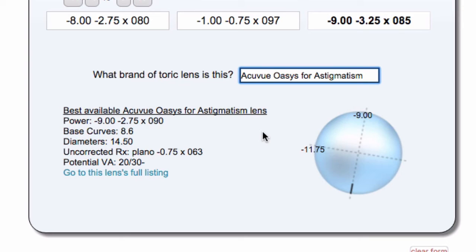And in this case, our axis is 90. Our cylinder power, the highest one it comes in is 2.75. And it tells you what, if you work with this lens, how close you're getting to the ideal lens. And in this case, we'd have about three quarters of a diopter of cylinder uncorrected. And if that works out like it should, our potential vision would be 20/30 minus, which with this prescription, you might find acceptable and might be worth a try.